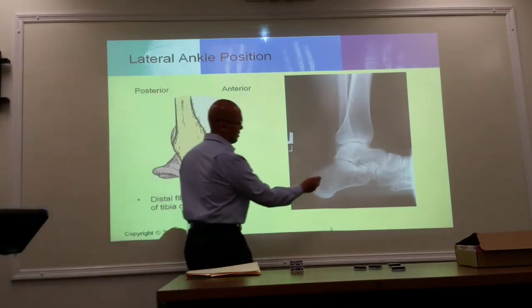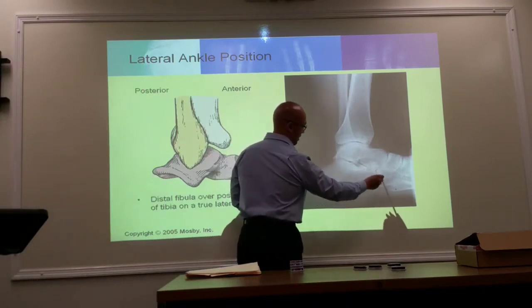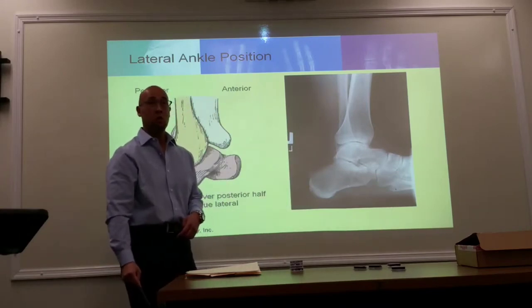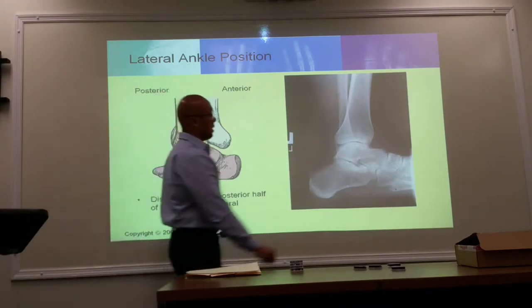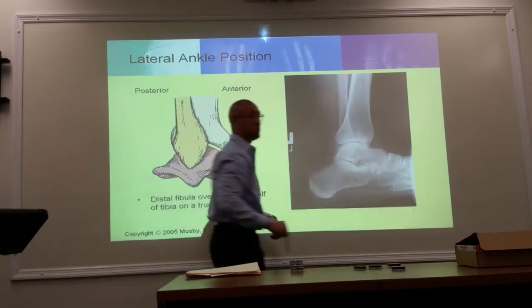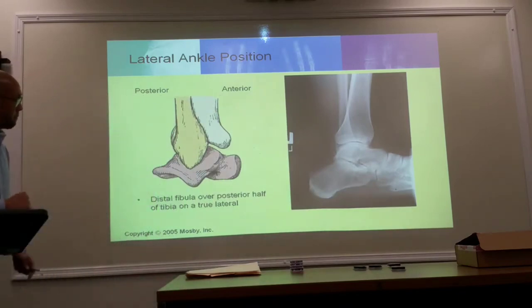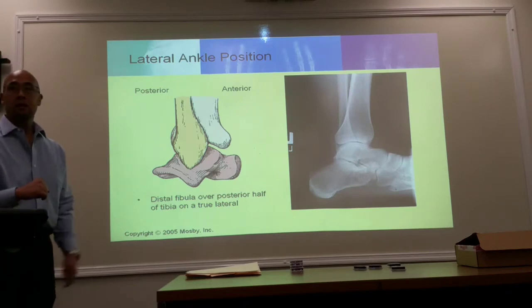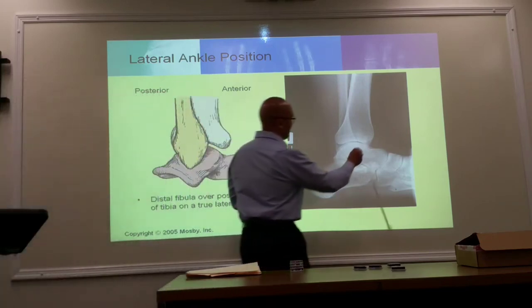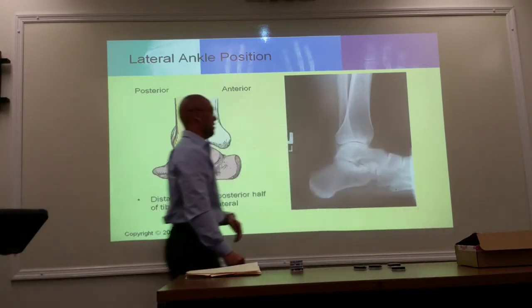So what bone is this? Calcaneus. What's anterior to the calcaneus? Cuboid. Then, what's this right here? Talus, and anterior to that is going to be your navicular. What about the navicular? What did I say? Oh, I'm sorry. Talus, navicular, and then your cuneiforms, superimposed.